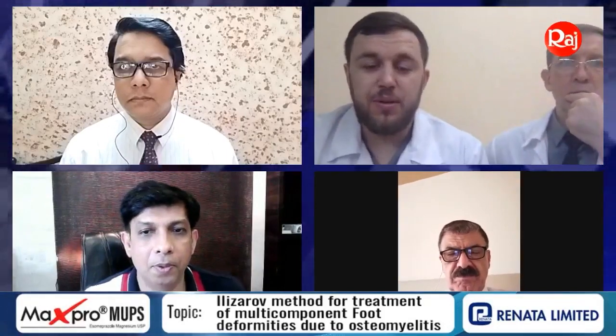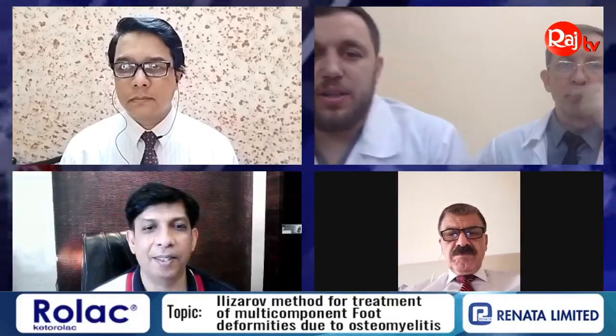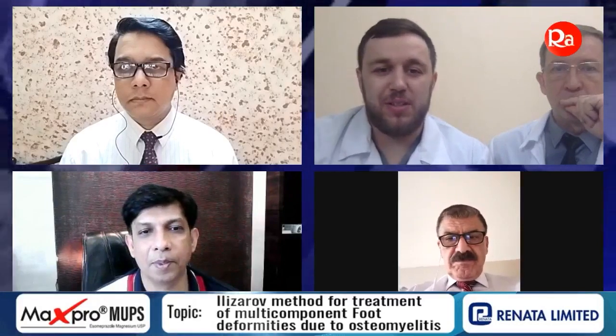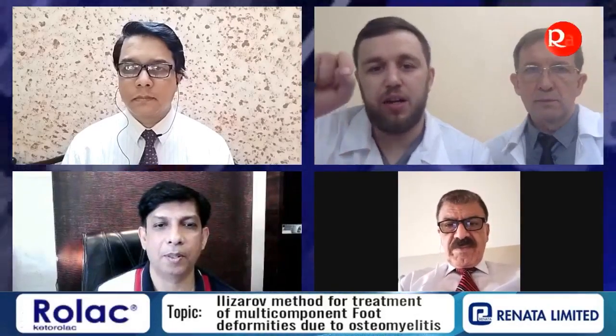Here is the technique we can apply; every surgeon can have some style of surgery, you know what I mean. So it's like a choice of the doctor. And what about me? For the protection of the stitches, I mean nail stitches, I like to insert those K wires for protection only.